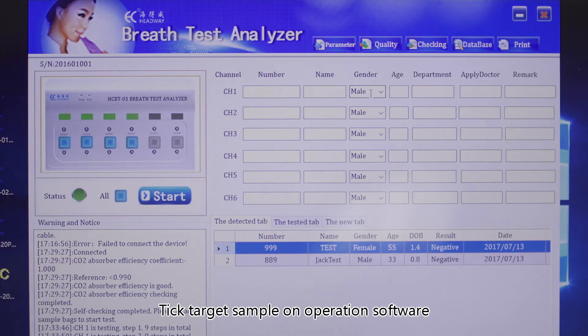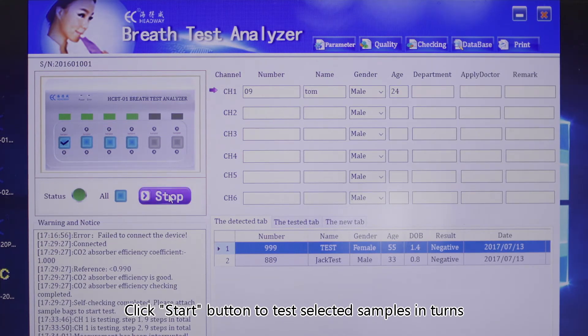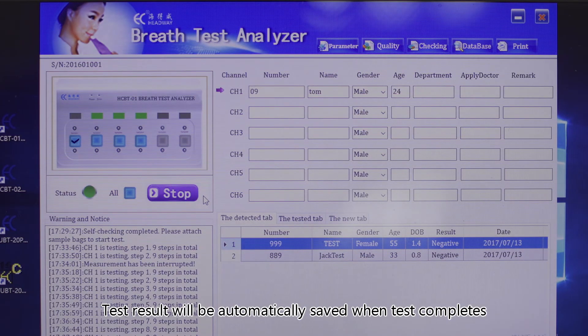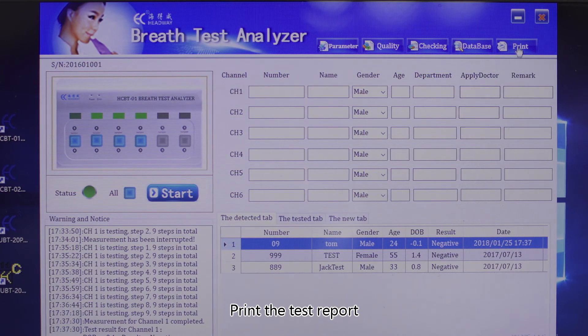Tick the target sample on the operation software. When the port is selected, the select box will show a tick symbol. Fill in the subject information for the corresponding samples, then click the start button to test the selected samples in turn. Test results will be automatically saved when the test completes. Print the test reports.